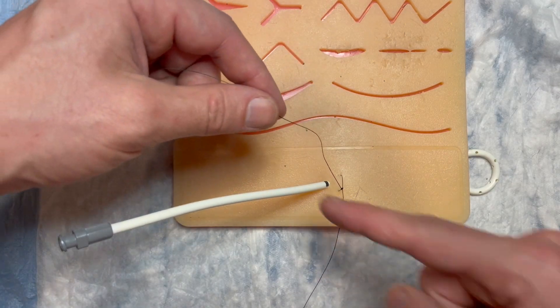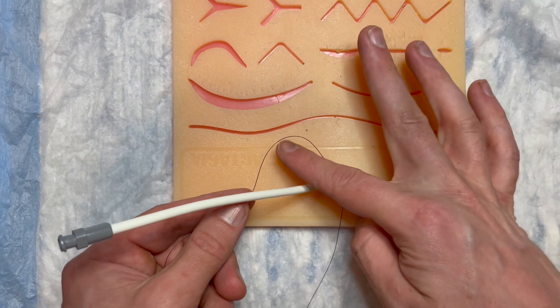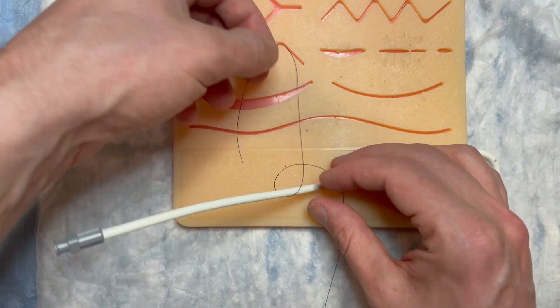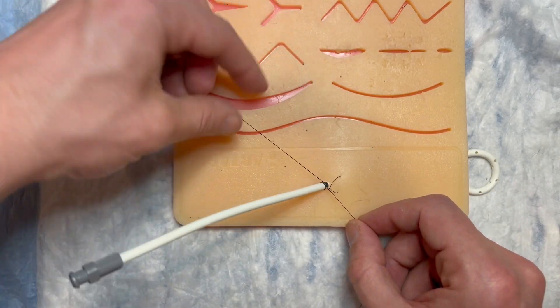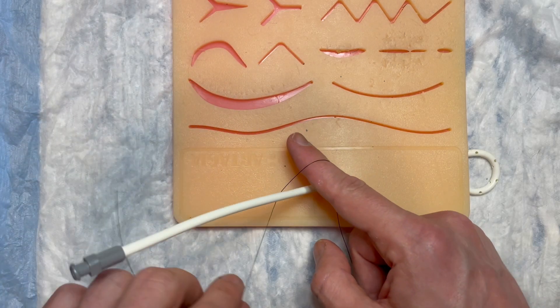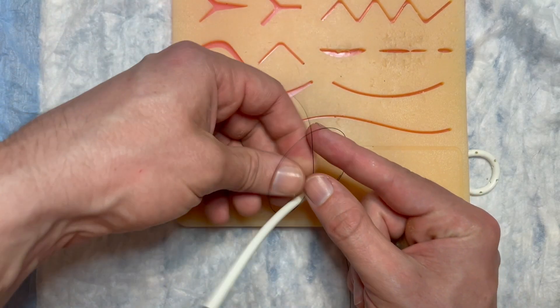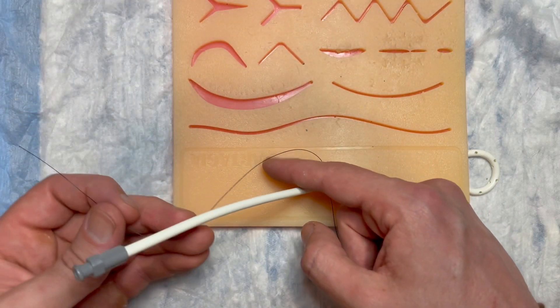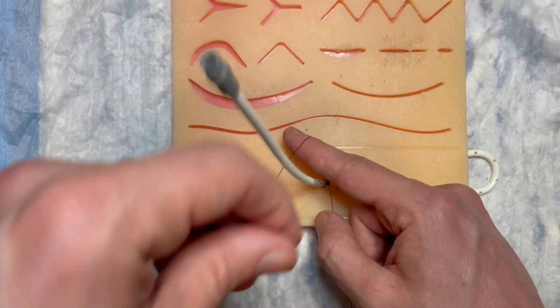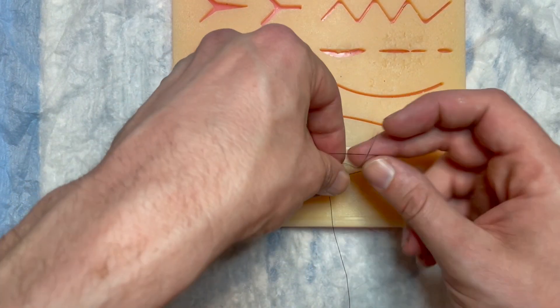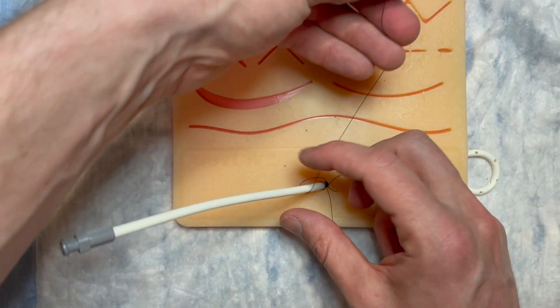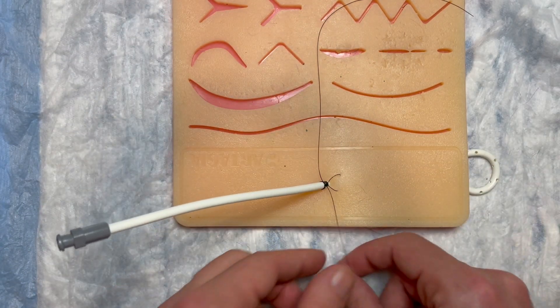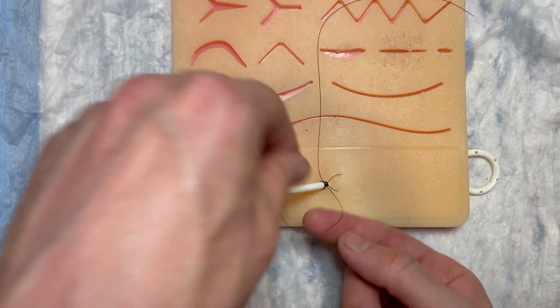I create L knots and you do it on one side at a time, so this is like the left side, this is the right side. So we're going to focus on this left side. On this left side I'm going to create a little L knot, all I'm doing is putting the suture through there. Do another one. We're going to do three passes on each side just stacking these strings on top of each other. All right, so there's my left side. Look how secure that is, I didn't even really tie anything off yet.